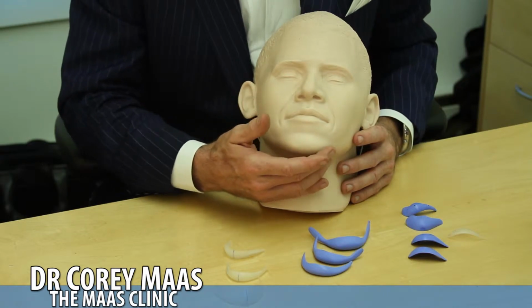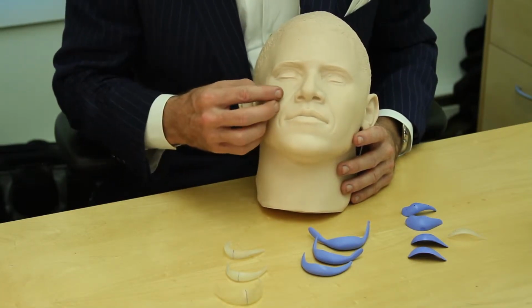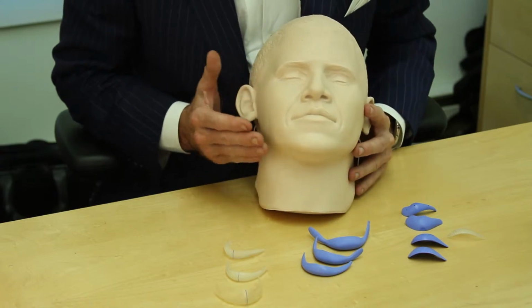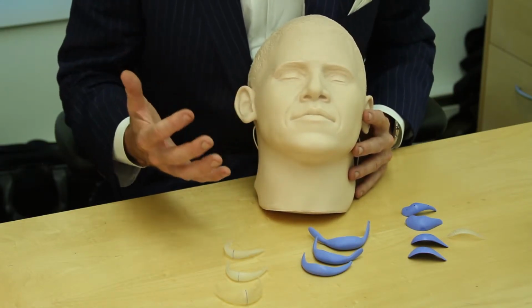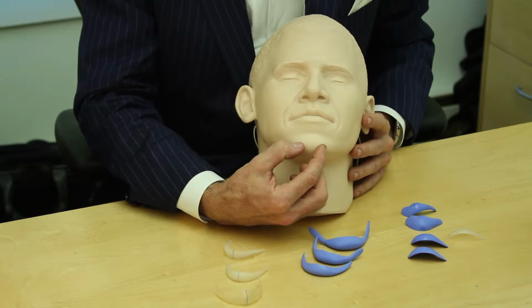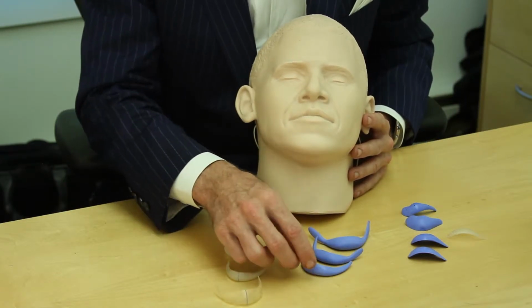So with facial implants, what we're doing is creating a space on an area that might be weak. Say the chin area or the cheek are two popular areas. Also, the angle of the jaw is an area where a lot of patients are looking for more contour. The beauty of the new preformed implants that are available is that we've gotten past this era where it used to be a little tiny button that we would put at the end of the chin here.